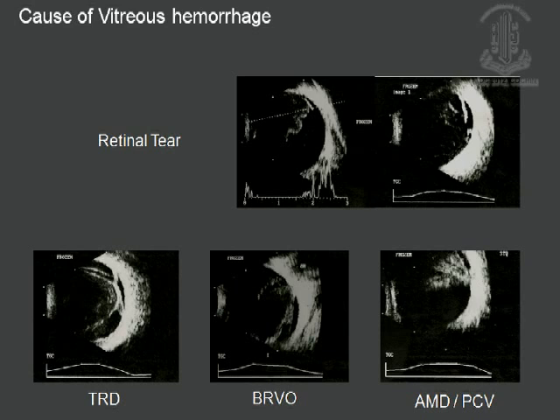Obviously, other obvious causes like tumors and all, which the subsequent speakers will be speaking on, will be picked up on ultrasound. Some of the tumors can present with vitreous hemorrhage, so that also can be picked up on an ultrasound.